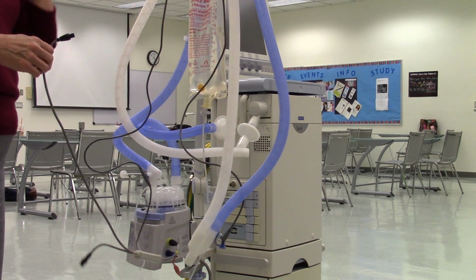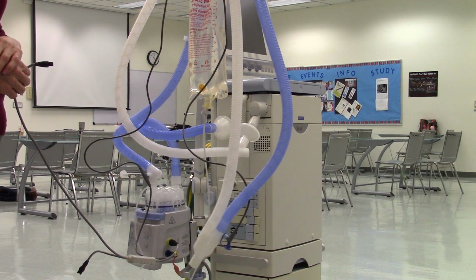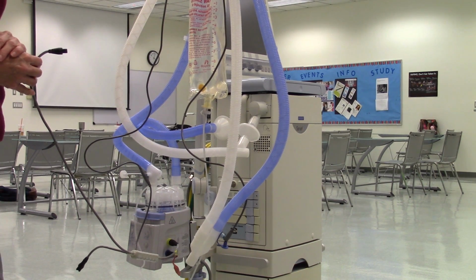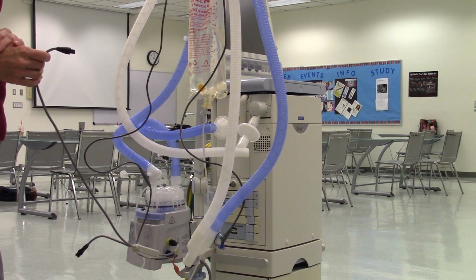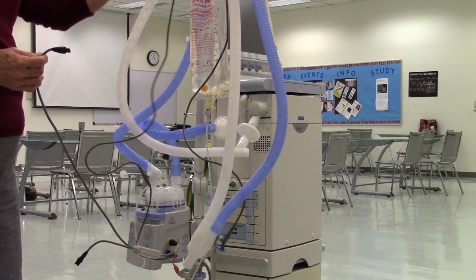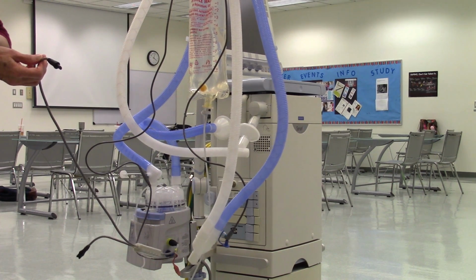It says the longest end connects into the port at the patient Y. Make sure it is the inspiratory side. The sensor senses the temperature of the inspiratory gas right before it enters the lungs. If the temperature reads below 39 degrees centigrade, the heater wires will turn on. If the temperature is above 39 degrees centigrade, the heater wires will turn off. Do you see wires inside the tubing? Yeah. And those wires will keep the gas warm as the gas flows past it.